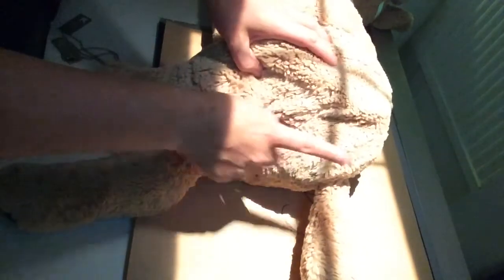For your collimation here we use UIS — umbilicus, ischium, and skin surface. So we've got our umbilicus, we've got our ischium which is our bum bone right at the very back, and we've got skin. So UIS — under informed suffers — and then I am going to colonate down.